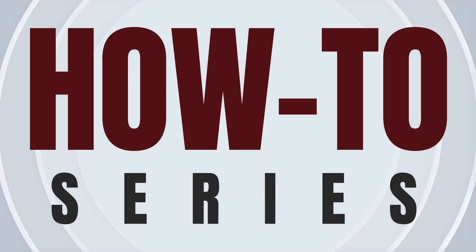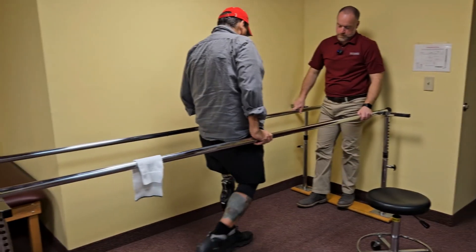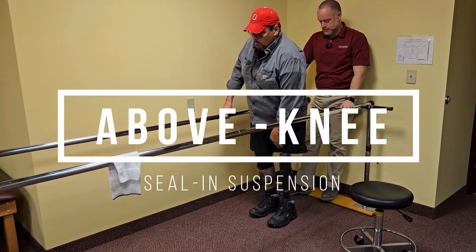Welcome to the Perry Prosthetics how-to video series. Today we are joined by prosthetist Ben Hammond and our friend Lee as we dive into the basics of seal-in suspension for above-the-knee amputees.